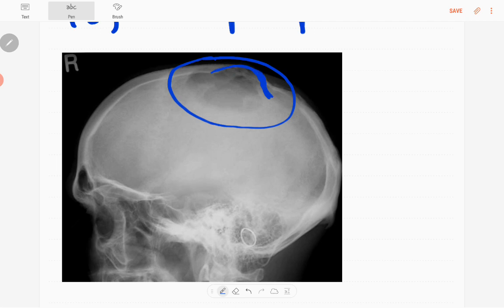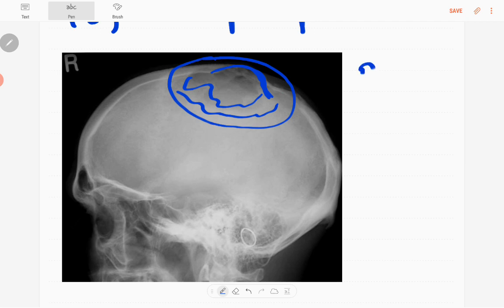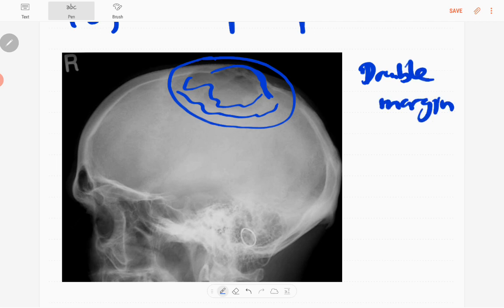It has beveled margins here. You can see beveled margins, so bevel margin, and narrow zone of transition is there. No definite soft tissue component or no periosteal reaction, no skull fractures.